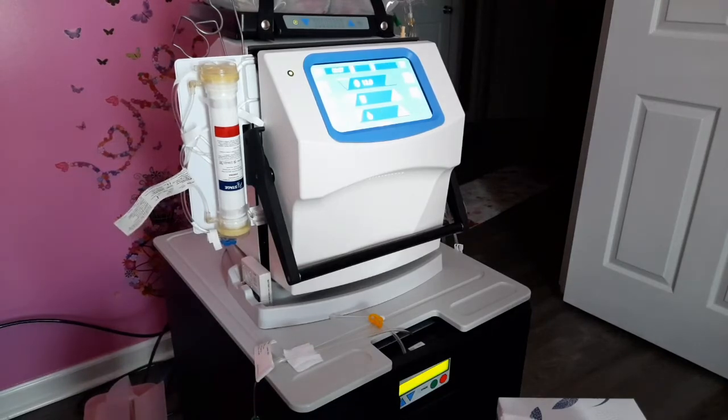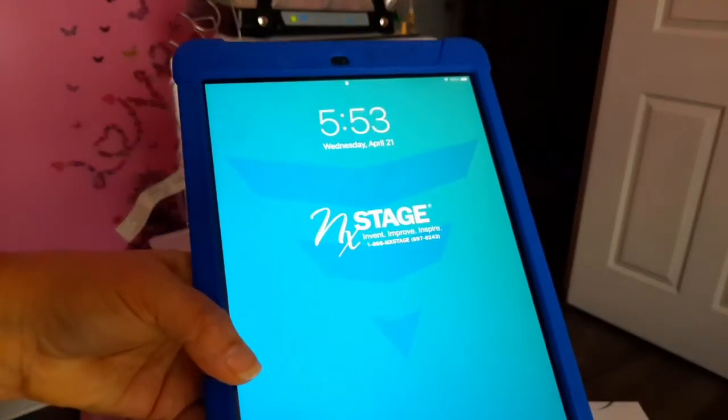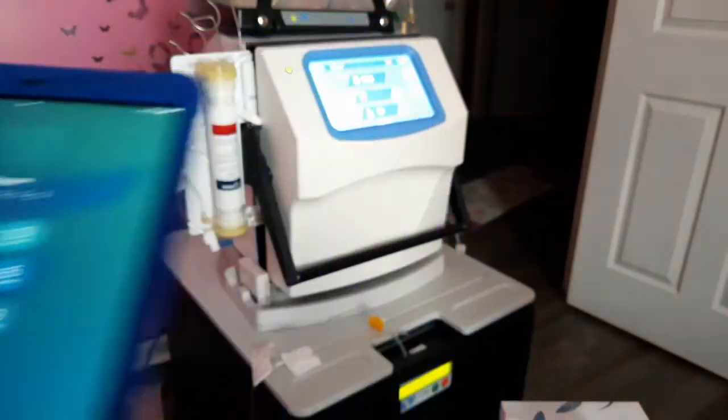And at this point, I'm going to weigh myself, take my standing blood pressure, my sitting blood pressure, and my temperature. And I'm going to chart it into my NxStage iPad. All right? So I'm going to do that, and I'll be back.